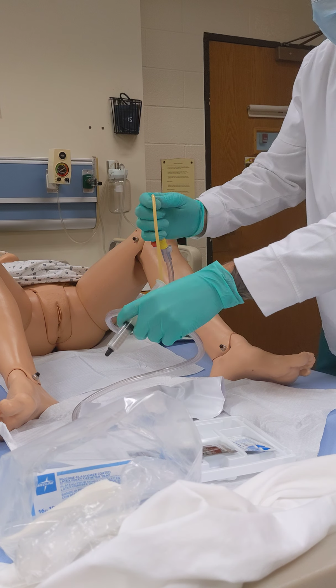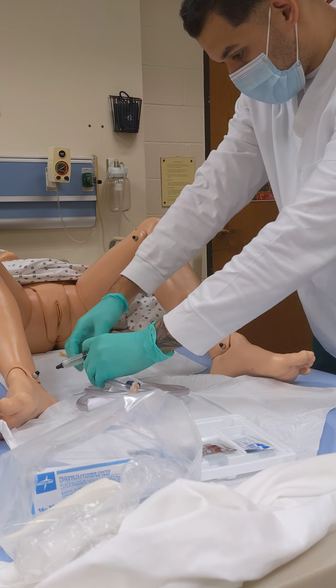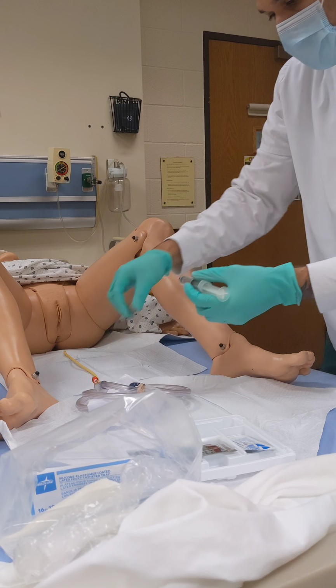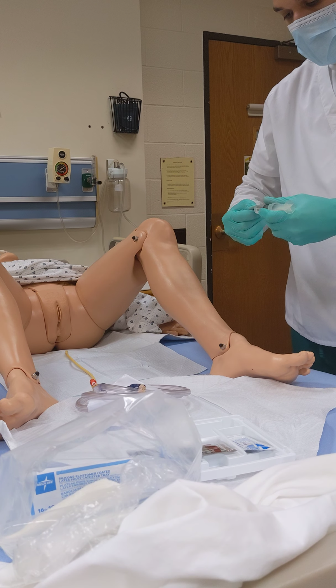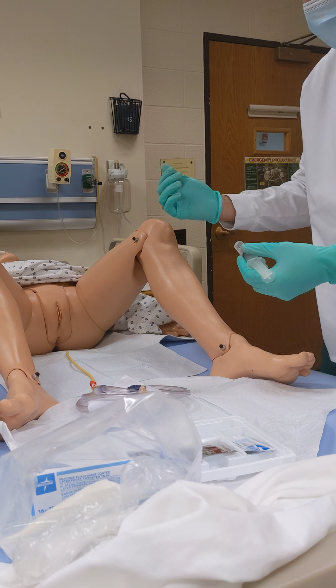I'm just prepping the catheter so that I have an easier time to work with applying the saline into the balloon.